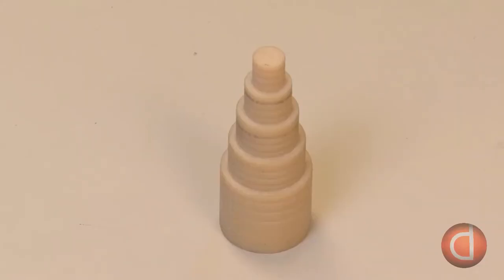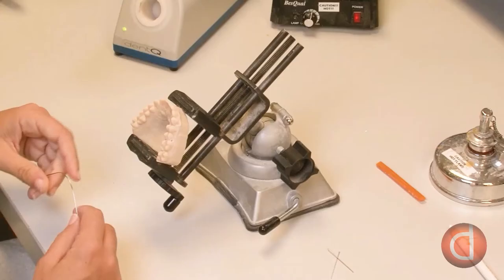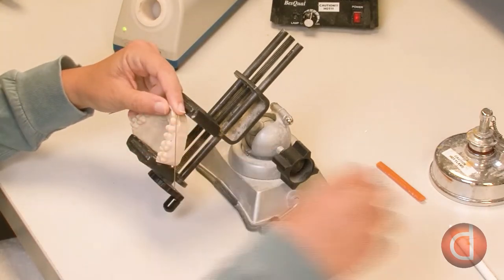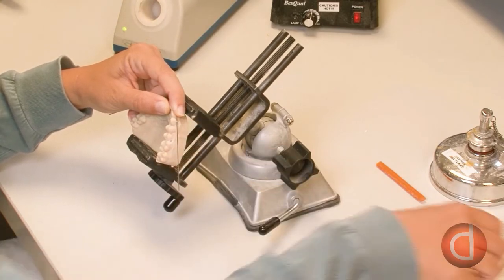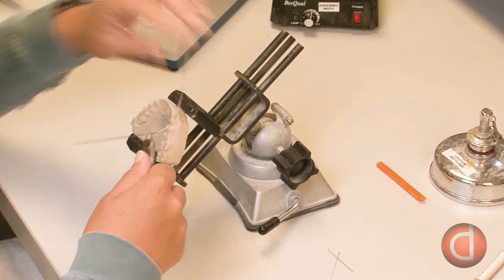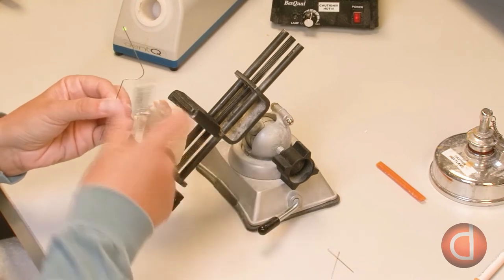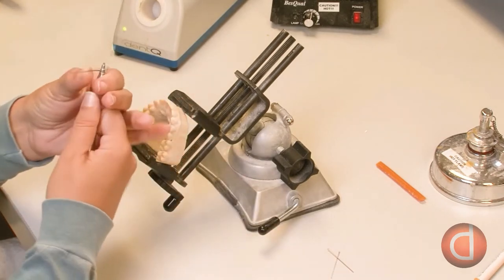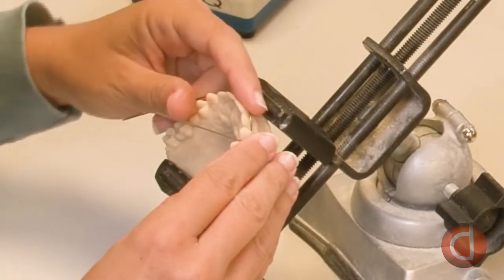Starting with a tool called a turret, the technician bends a piece of stainless steel wire around the turret to create an arch form. The technician places the arch form, known as the labial bow, over the front of the model and marks where she is going to make an adjustment loop. Using single beak pliers, she clamps the wire where the mark was made and makes a 90-degree bend, then uses a loop forming plier to form the rest of the adjustment loop.